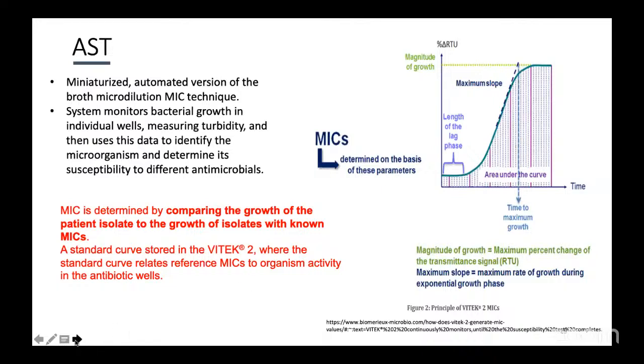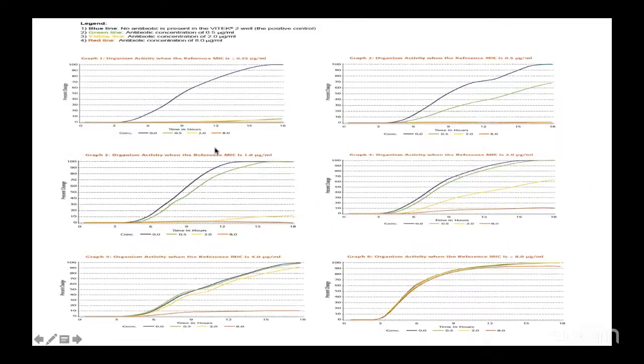And that is what the algorithm does. So what is the length of this phase? How fast is it increasing? What is the area under the curve? All these are built into the system.